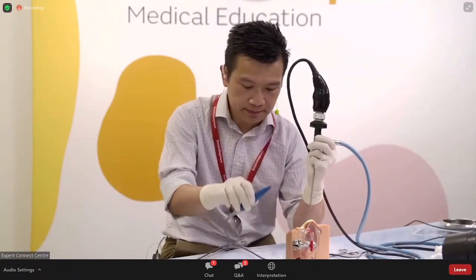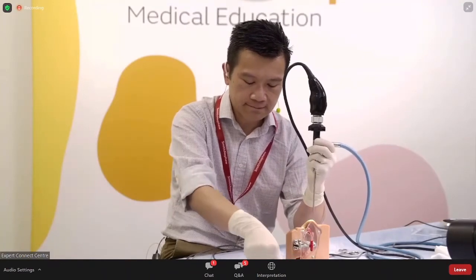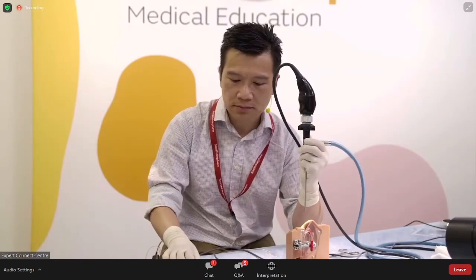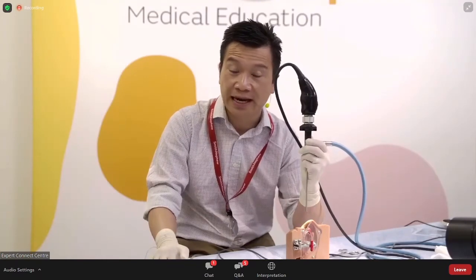Okay, and there is another attendee who says, if you injure the periosteum while directing the turbinator towards the bone, is there any evidence that this causes crusting, etc., as I understand from the Reflex 45 talk? So we have never experienced necrosis of the inferior turbinate with the turbinator. Very different experiences when we were still using the SMD needle, where every third or every fourth patient will have significant sloughing of the mucosa, which ends up being necrosis or partial necrosis of the inferior turbinate. Certainly with the turbinator, and in the last 4 years that we've used it consistently for our day case procedures, not one of our patients has had necrosis of the inferior turbinate.